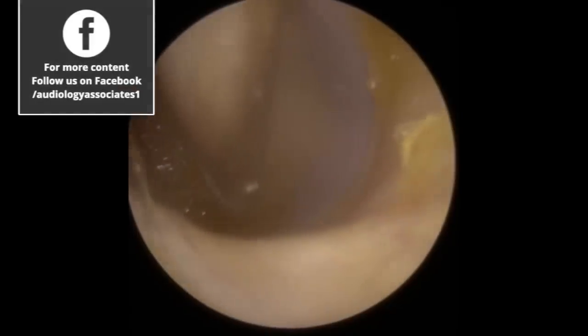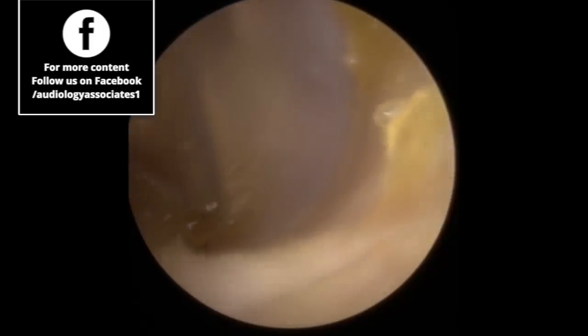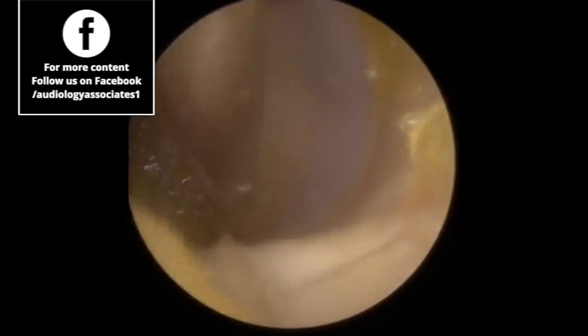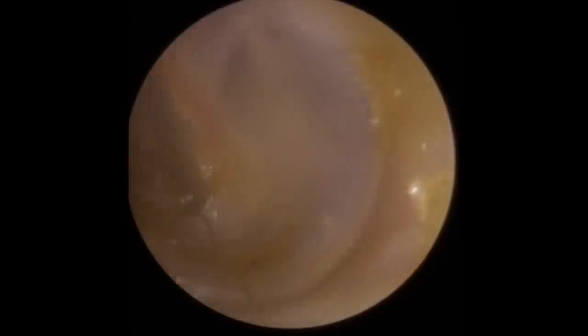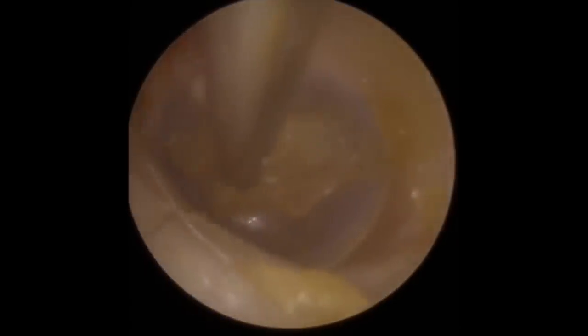What we want to do is get a grip. If we can stay away from this piece and suction it towards us, that would be the best option, but not always the case, because sometimes these can be quite stuck to the drum itself. So we're just going to very gently move our way down, just trying to get a good grip on this last little bit of wax. Not putting much pressure on, because we obviously don't want to run the risk of doing any damage to the eardrum. There. Did you see that just pull away and onto the actual suction itself?